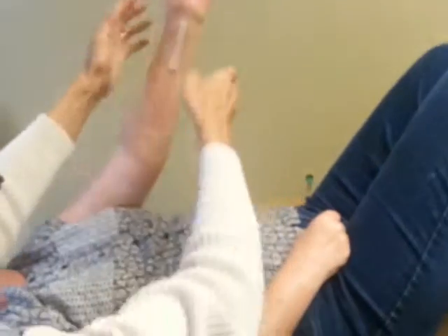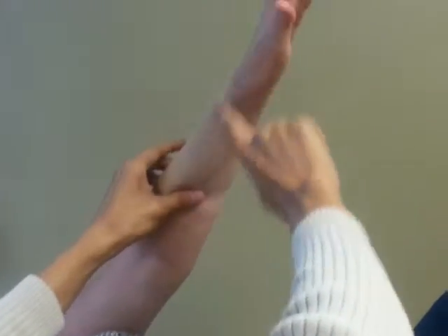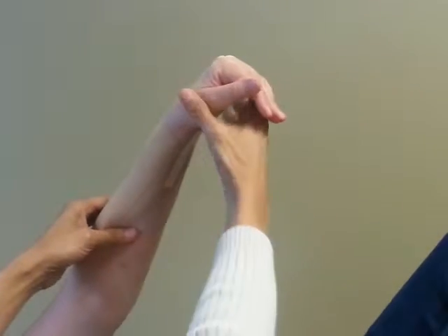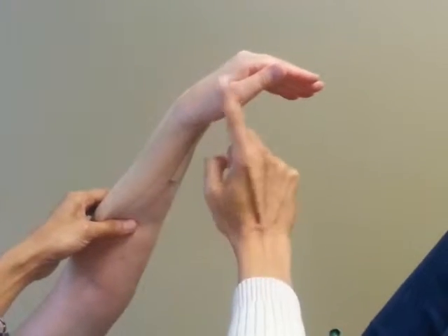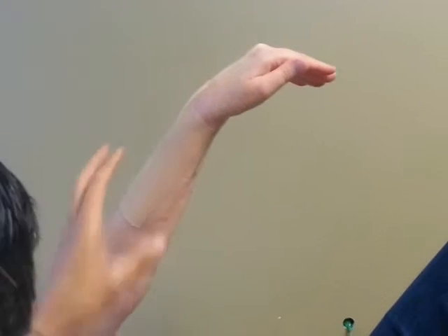So that's how you do it. Now when you do this one, you do the same thing — you start here and pull this way. You want it to cover probably a little bit of the wrist right here because the damage was done right here. Wherever it's swollen, you want to cover it. Then you want to bend it away — bend it this way. Bend it as best as you can in that direction, then pull it this way, tape it and anchor it down that way. Just do it the reverse of the video. That's for inflammation.